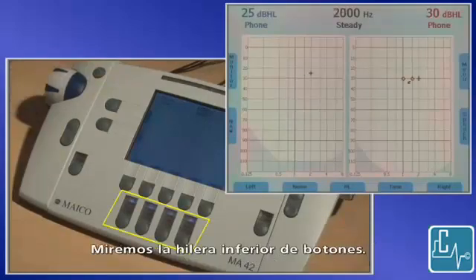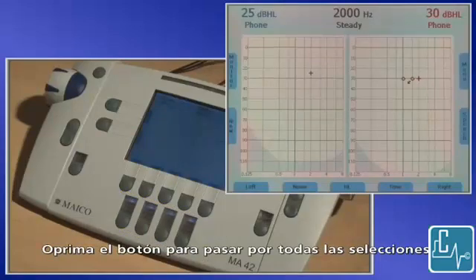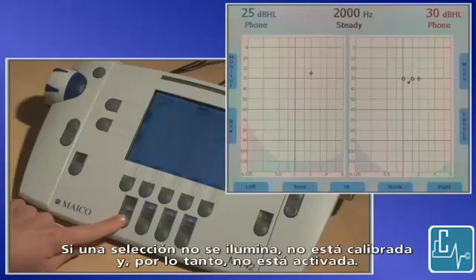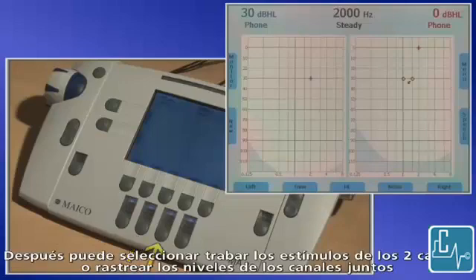Let's look at the bottom row of buttons. Transducers can be selected with the two outside buttons, one for each channel. Press the button to toggle through the selections. If a selection does not light up, it is not calibrated and therefore not activated. Change the tone to pulse or warble with this selection button. You can also select to lock the stimuli of the two channels or track the channel levels together.